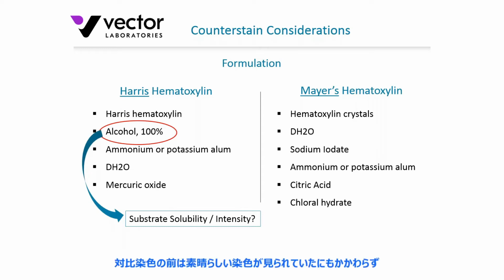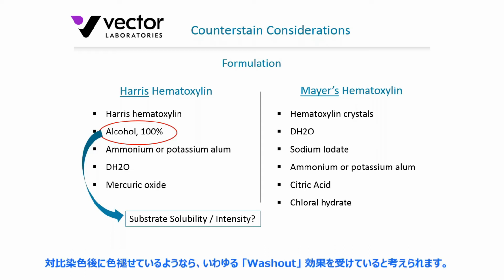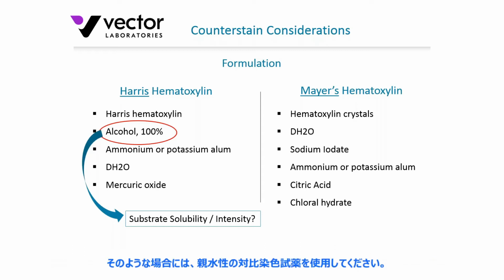And so if you do look at that under the microscope prior to applying the counterstain, you may say, hey, this is really nice specific staining I've got here. But after the counterstain, it may look a little duller or washed out, or indeed, have suffered some sort of washout effect. So in these cases, I'd highly recommend going with more of an aqueous-based counterstain recipe.